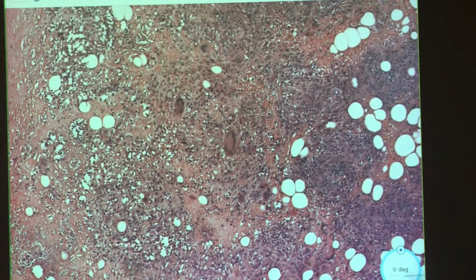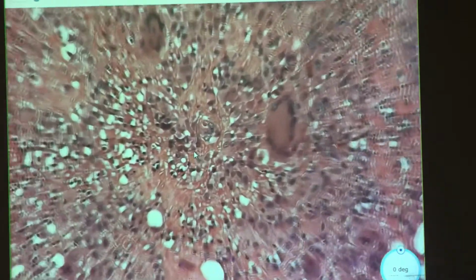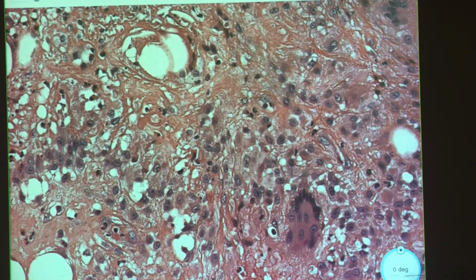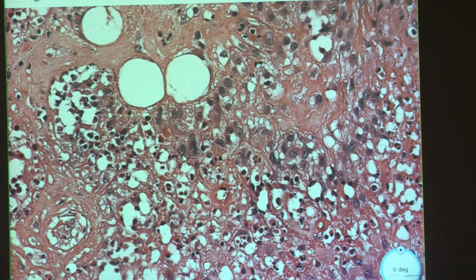I mean, there's some giant cells. And then, are these a little foamy maybe here? Yeah, they're a little on the foamy side. So more foamy, yay! Like that's the theme of tonight, right? Yes.